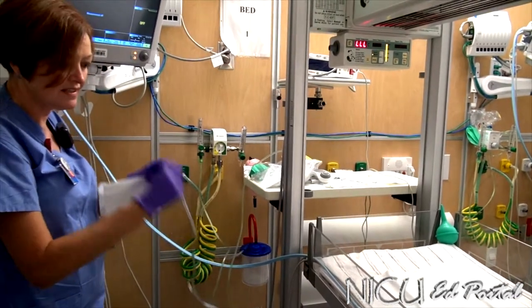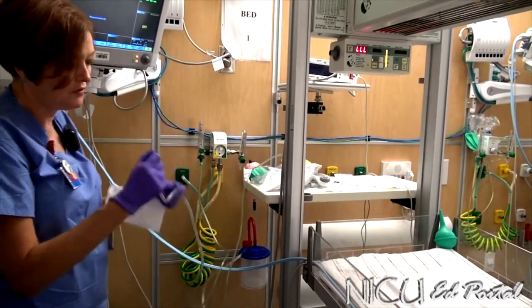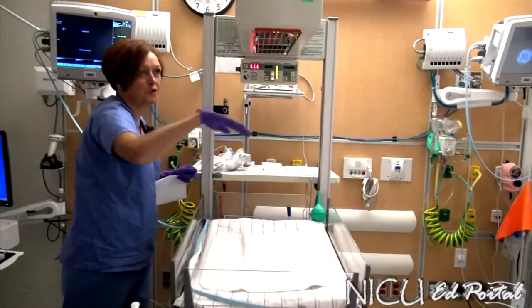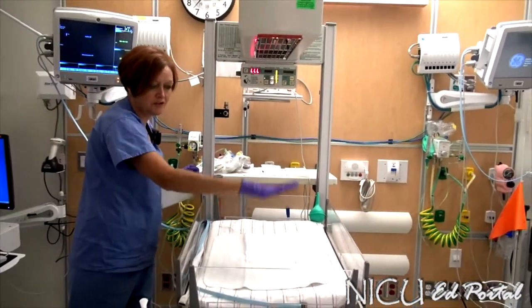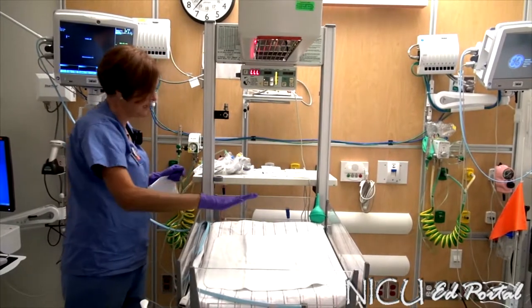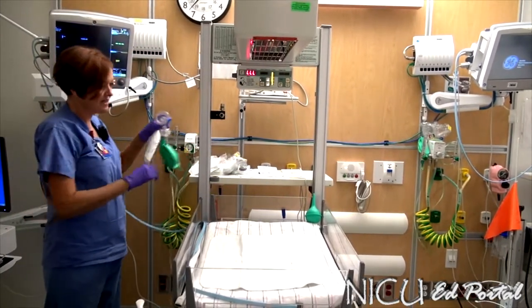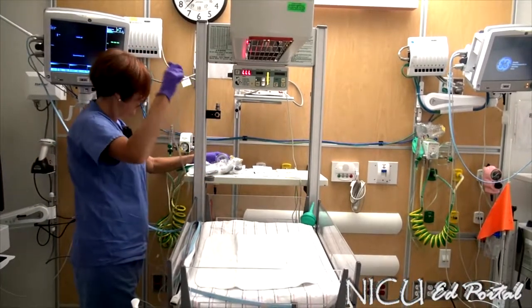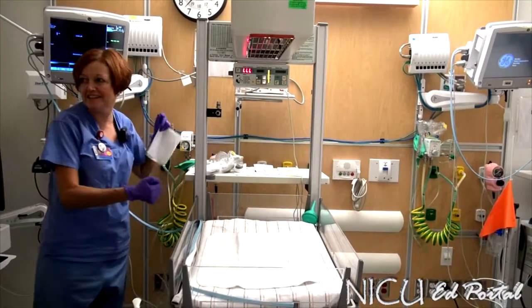So there we have it — three things set up ready to go for our delivery. Our bed is on and it's become nice and warm; baby's going to come over to a warm table, which is a great thing. We have our bag set up for our oxygen. We have our bulb syringe at the bedside, and we have our suction catheter all set to go.